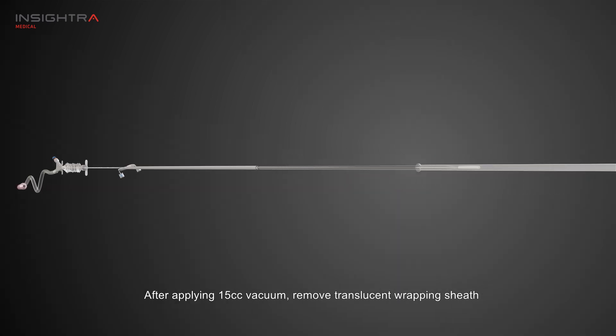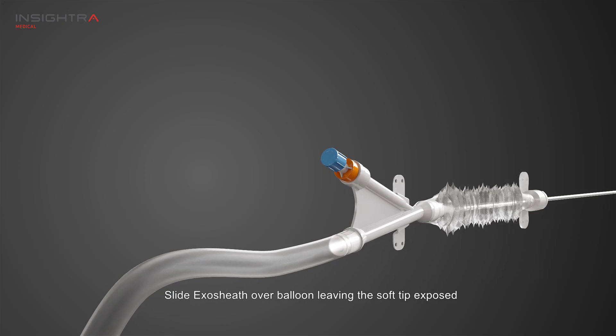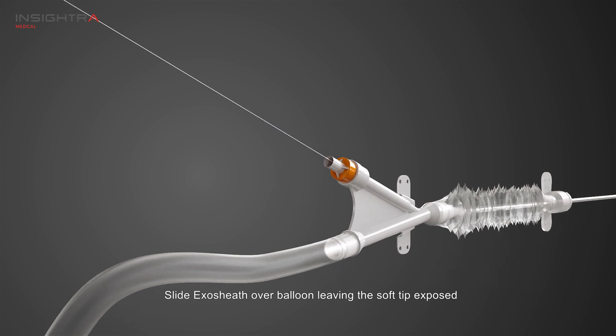After applying 15 cc vacuum, remove the translucent wrapping sheath. Slide the exo-sheath over the balloon, leaving the soft tip exposed.